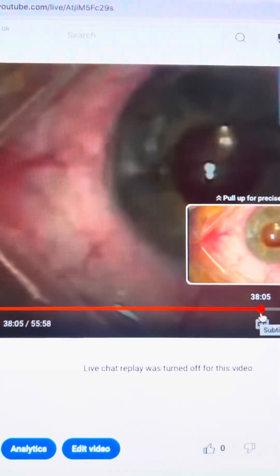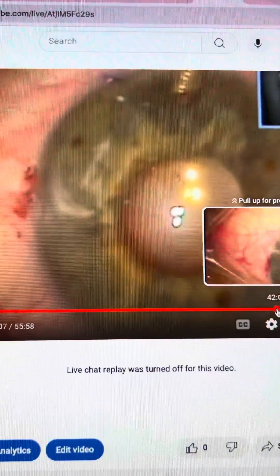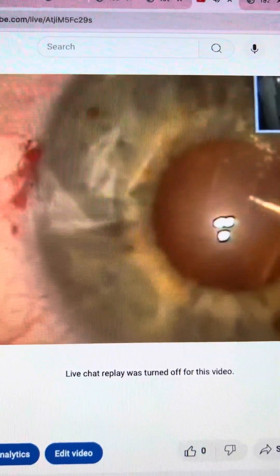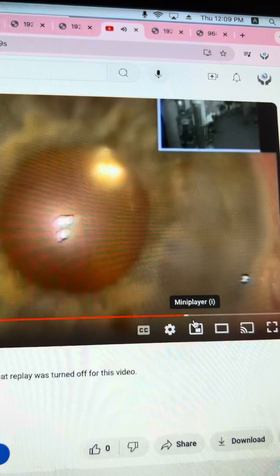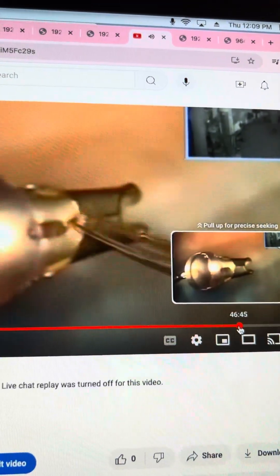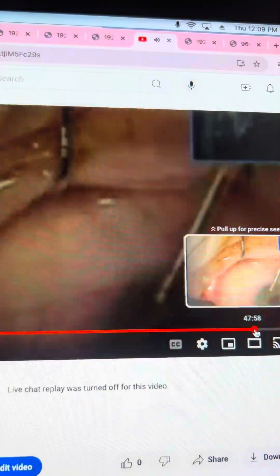First we find the pre-cut cornea that we received from Corneagen. Then we go and dissect the Descemet's membrane. We can see how nicely, after scoring circularly with the reverse Sinskey hook, we're carefully removing the damaged endothelium and the thickened Descemet's membrane, using my friend Massimo Busin's ingenious spatula. We had ordered the graft to be about 100 microns, and it is indeed.